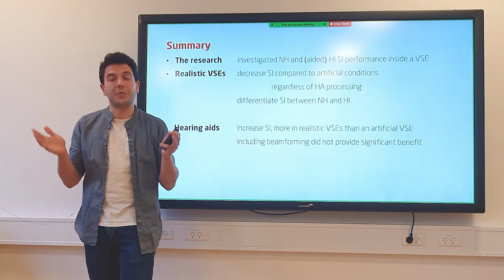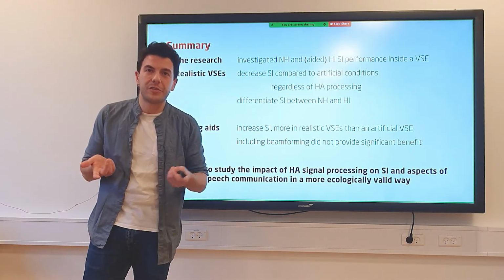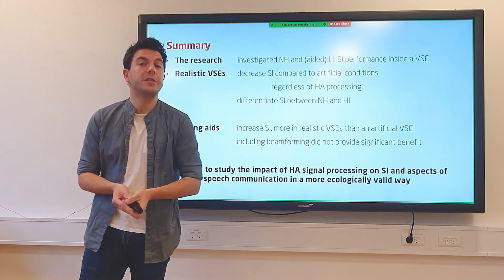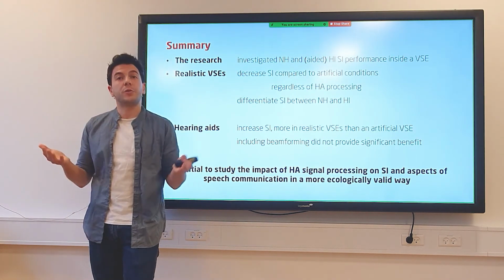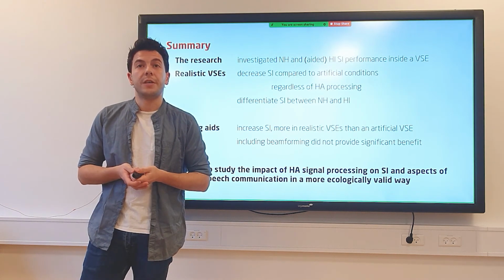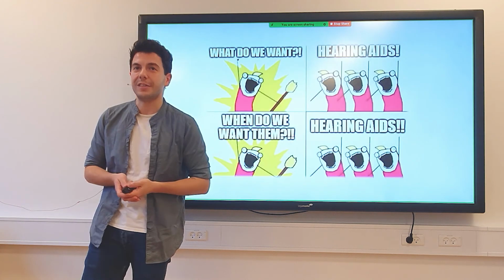So to round up, overall I feel that this research shows the potential of these virtual sound environments to study the impact of hearing aid signal processing on psychoacoustic outcome measures like speech intelligibility or speech communication in a more ecologically valid way, which I think these guys would love to hear.